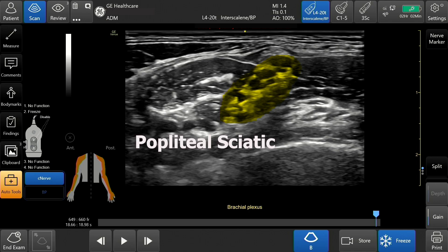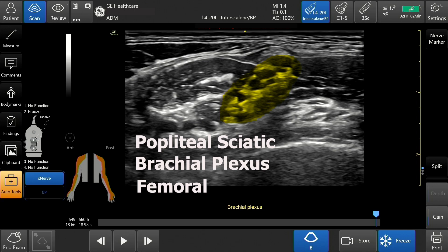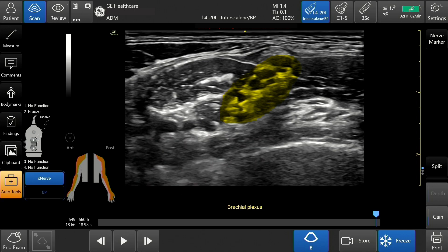Popliteal sciatic, brachial plexus, and femoral nerves. C-Nerve can be used on the following probes: L4-12-TRS, L4-20-TRS, 12-L-RS, ML-6-15-RS, and the 9-L-RS.